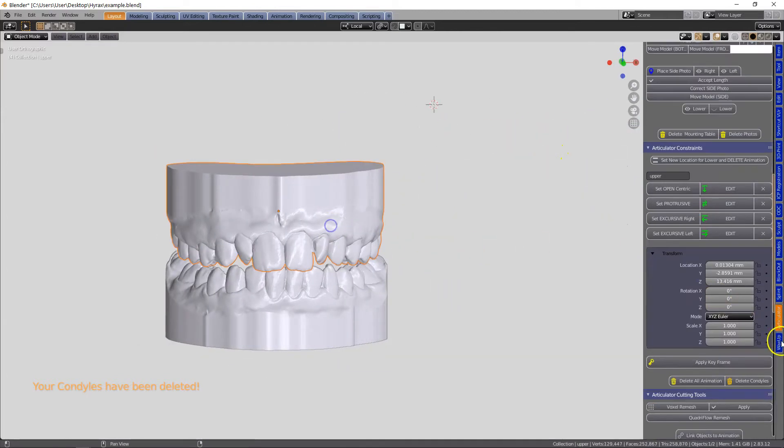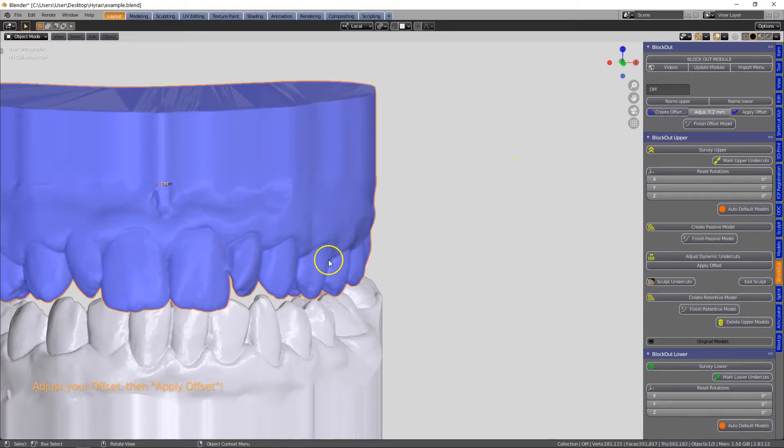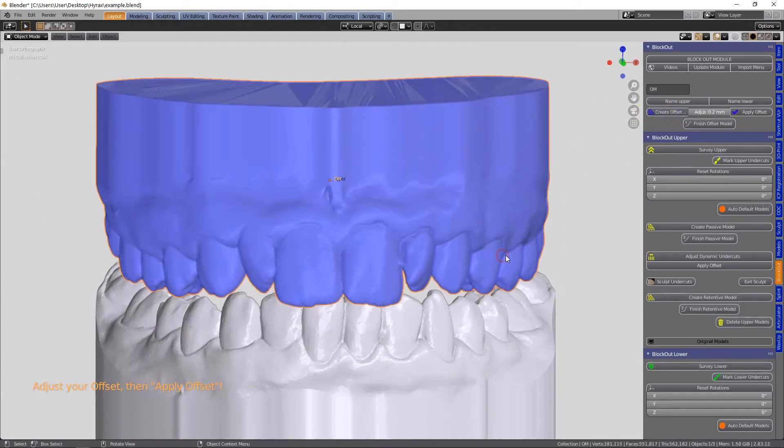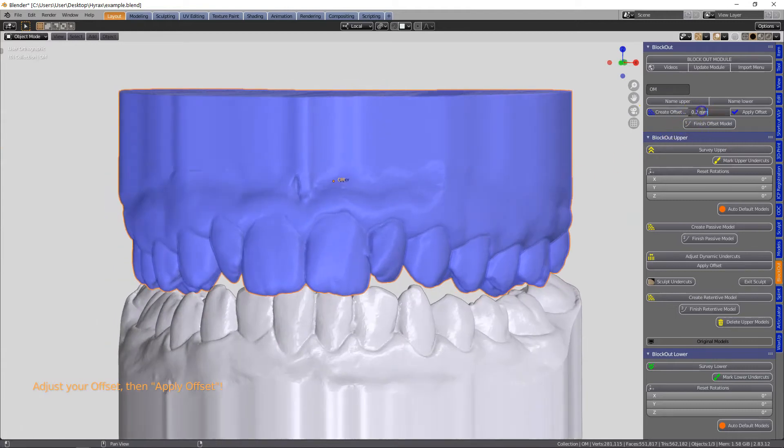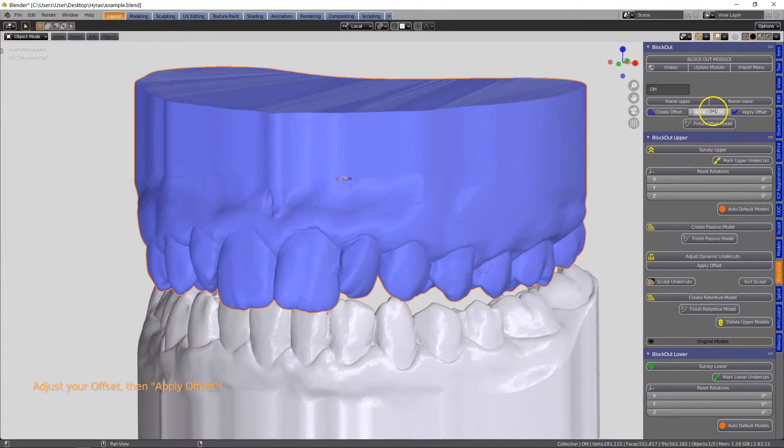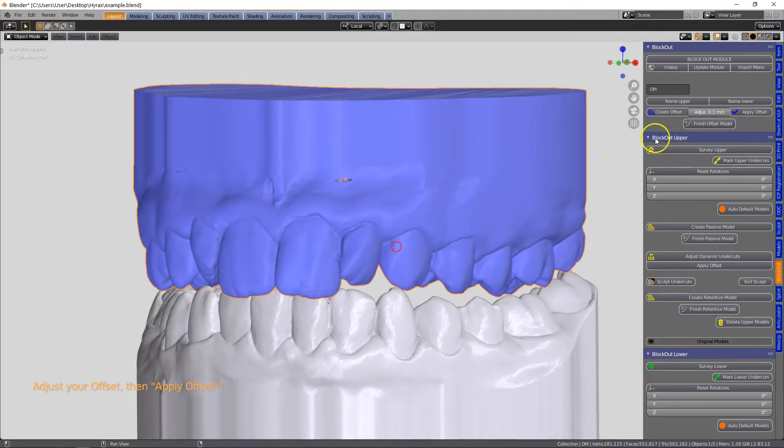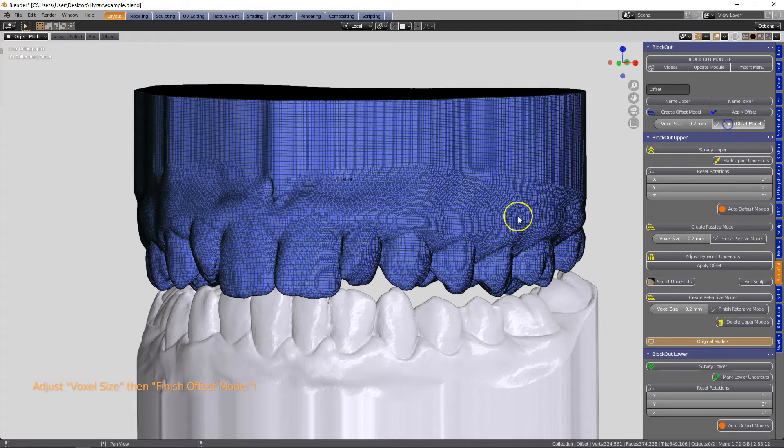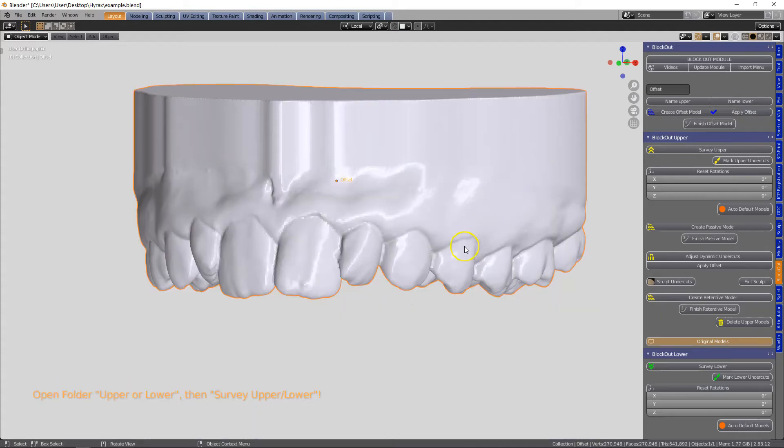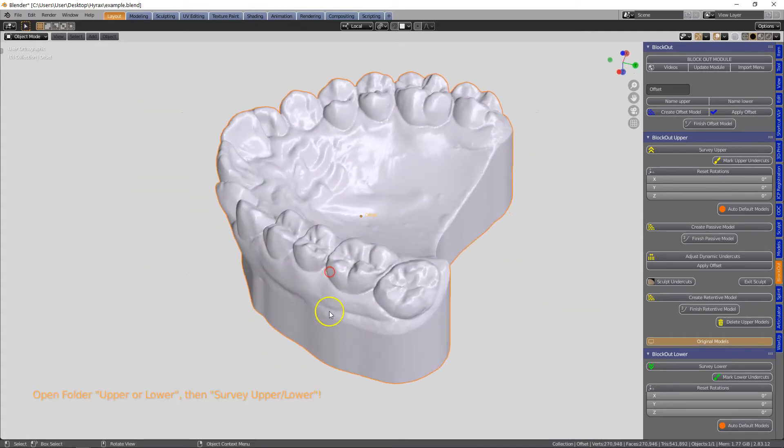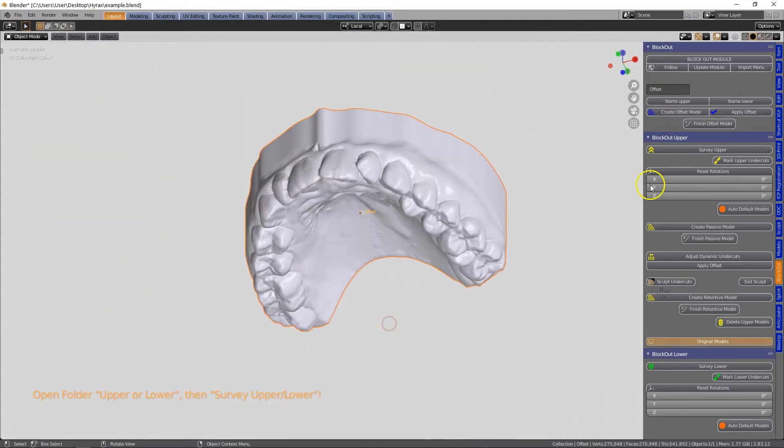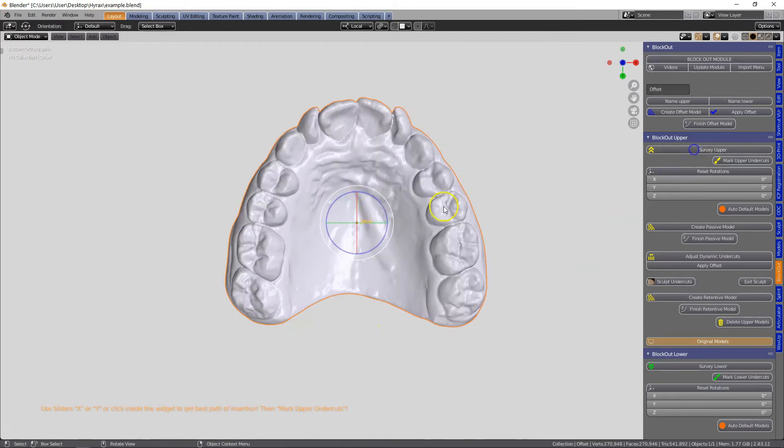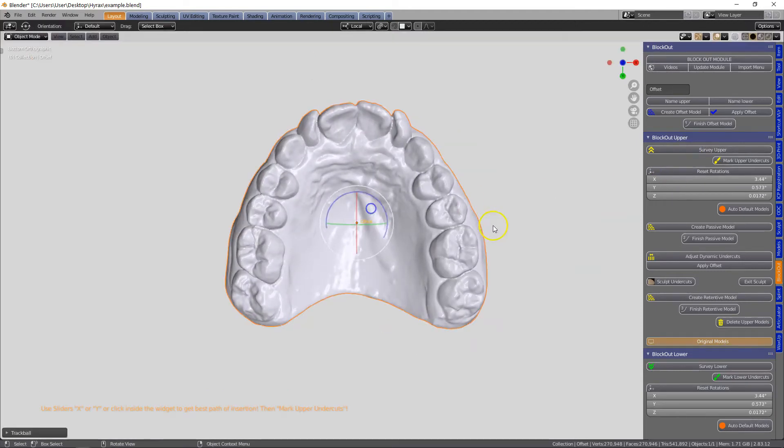Then we're going to set this open permanently and we're going to take away the condyles, we don't need them anymore. Then what we're going to do is we're going to block out this model and I have set this to 0.1, something you need to discover for yourself for the best fit for laser sintering. We're going to apply this and then remesh the model and survey it.